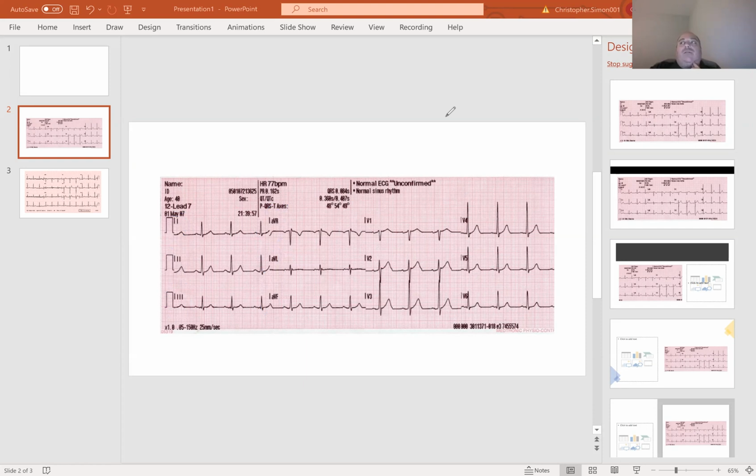So I like to think of it like a camera angle. If you had a person doing a photo shoot, for example, that person might stay perfectly still, and a photographer might wander around them taking shots from more of a straight on, a left, a right, up, down angle, whatever the case may be. So that's a similar type of thing that's going on right here.